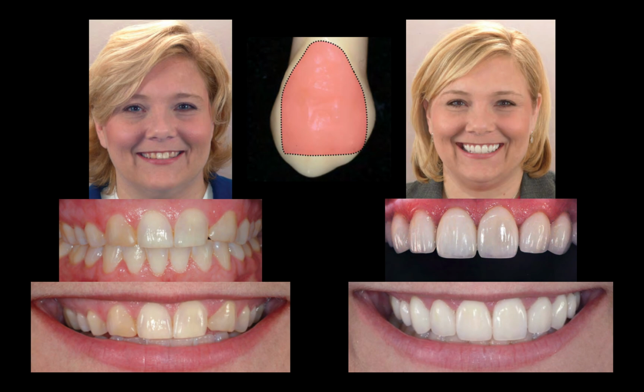Now, bilateral canine substitution, most often, if it's done in the literature, is due to congenitally missing lateral incisors. And so here, this was a patient in the literature they talked about. The patient was born with congenitally missing lateral incisors, and when she was a child, her orthodontist did bilateral canine substitution, and her general dentist just added some composite on the canines. So these are the canines here. And you can see that the color match isn't really great. The midline was completely off. And so what they did was they redid the orthodontics, and then they fabricated some brand new veneers. And you can see it's just an absolute beauty of a result that they got.